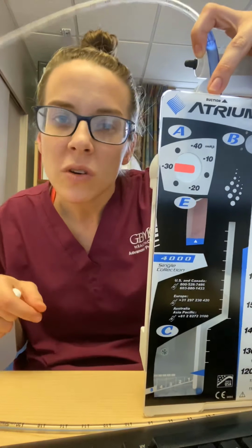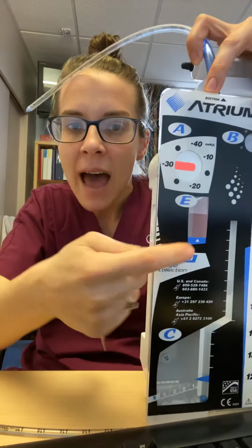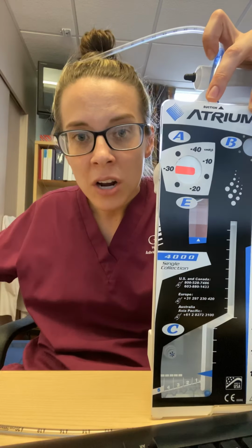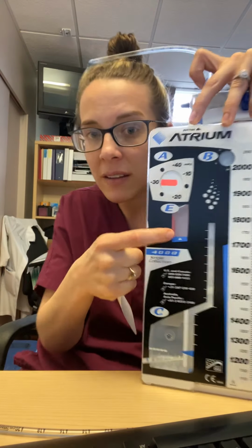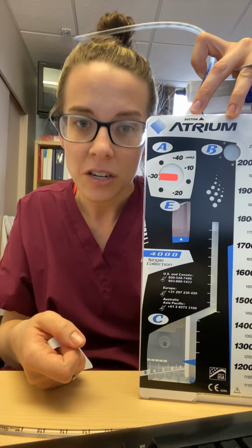So most videos recommend turning the suction on the wall up until about 80 minimum, and then that will pop your balloon out to know that, okay, now I know I'm at minus 30 suction. If you turn the wall suction on and you want minus 30, but you don't see this balloon inflate to that arrow line, you've got to turn the wall suction up more to achieve minus 30 suction.